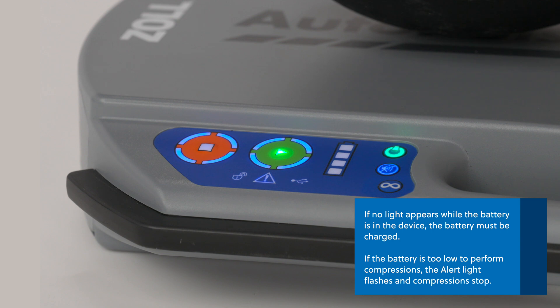If the battery is too low to perform compressions, the alert light flashes and compressions stop.